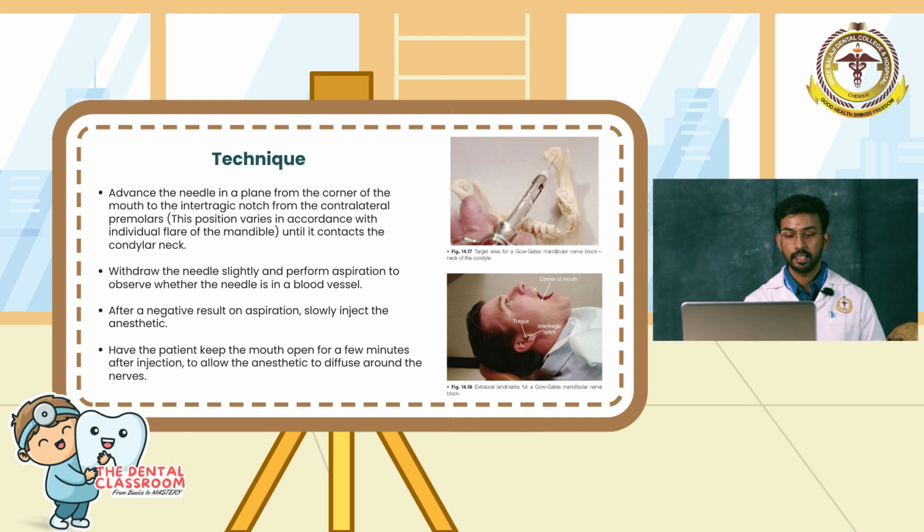Withdraw the needle slightly and perform aspiration to observe whether the needle is in a blood vessel, and if it is negative, slowly inject the solution. Have the patient keep the mouth open for a few minutes after injection to allow the anesthetic solution to diffuse around the nerves.